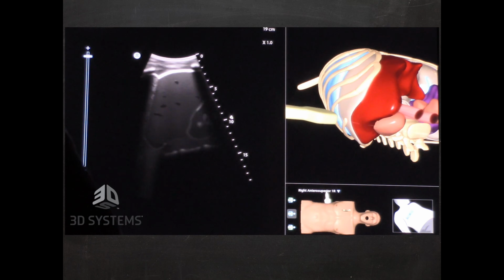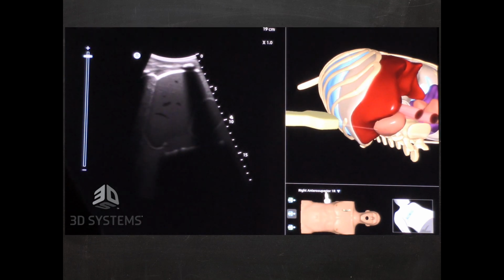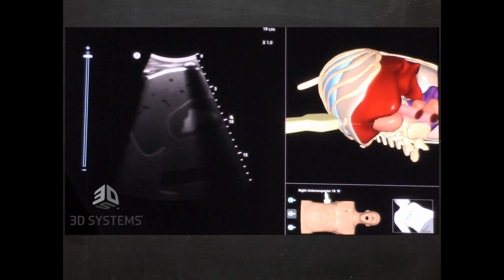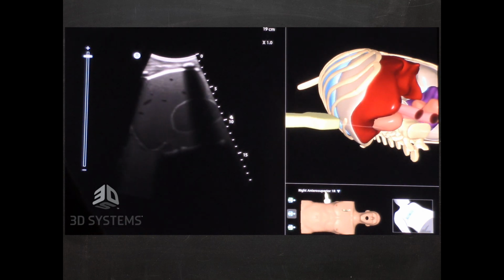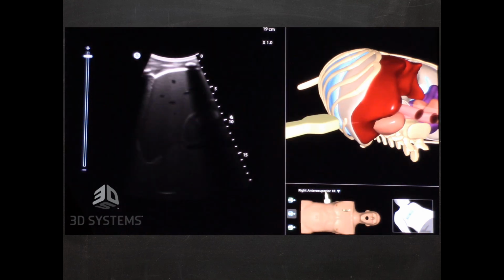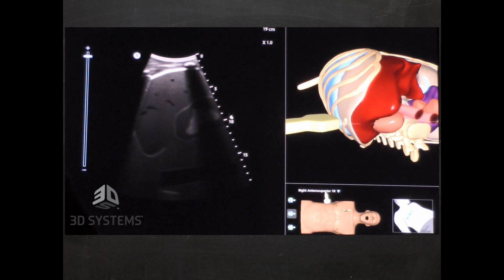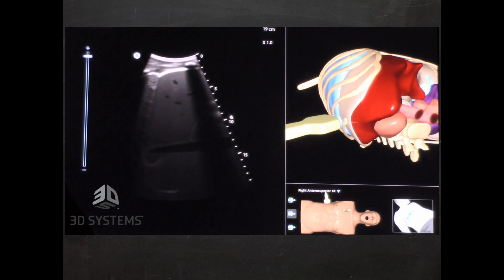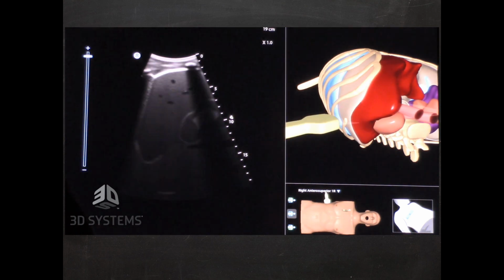When you look at the sonographic image, you can see the liver here with lung tissue on the left side of the screen. As the beam travels to the far field, spine should appear as a lumpy, bumpy, hyperechoic line. Look for the aorta and the IVC as the beam fans through. Remember, the IVC goes through the liver. Additionally, it can be helpful to correlate the vessel location to the spine. Finally, a slight rotation to fit within the ribs can be helpful to optimize your window here. Try locating all these different structures at bedside and correlate the different probe motions to what happens on the ultrasound image.